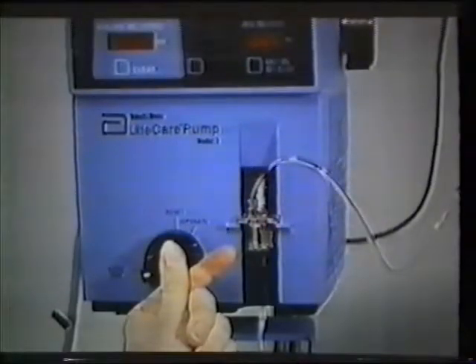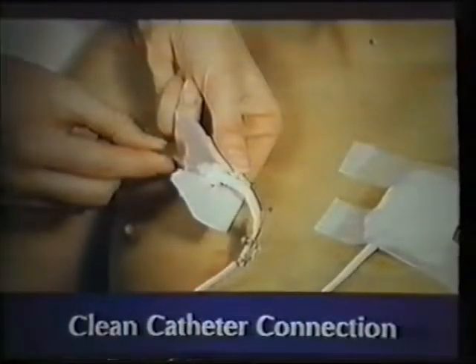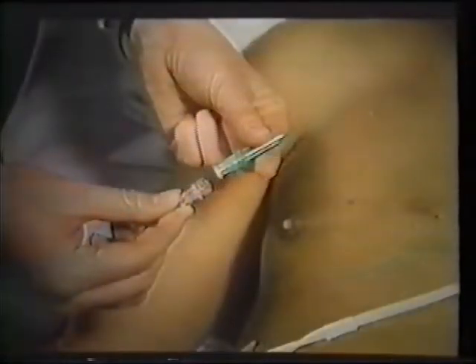If an IV is running, stop the infusion and clamp the catheter. If the patient has a double lumen catheter, turn off all infusions running in either lumen. Remove the tape at the connection between the catheter and IV tubing. Clean the connection with an alcohol wipe or povidone iodine swab. Remove the IV tubing from the catheter and connect the 6 milliliter syringe. Pay strict attention to asepsis whenever handling the catheter, especially at the connector. Place a needle on the end of the tubing to function as a temporary sterile cap, and set the tubing aside.